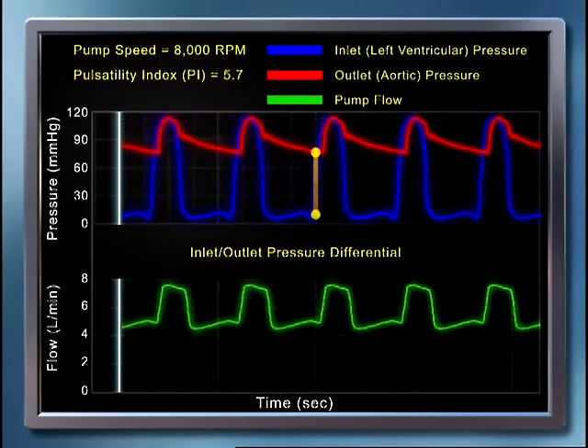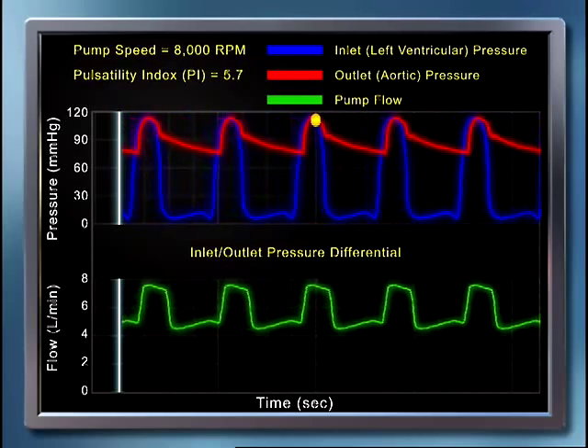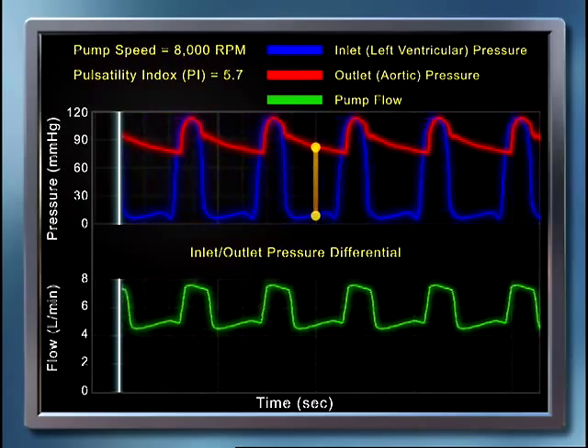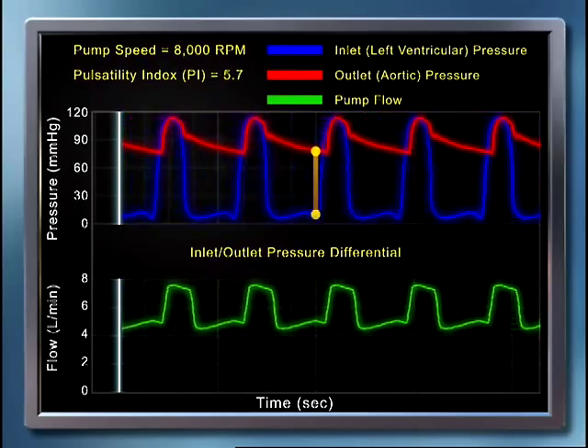A parameter that can be used to describe the magnitude of pulsatile flow across the pump, relating to the degree of ventricular contractility, is referred to as the pulsatility index, or PI. The higher the PI value, the greater the fluctuations in flow over the cardiac cycle. In this example, at 8,000 RPM, the PI is 5.7.